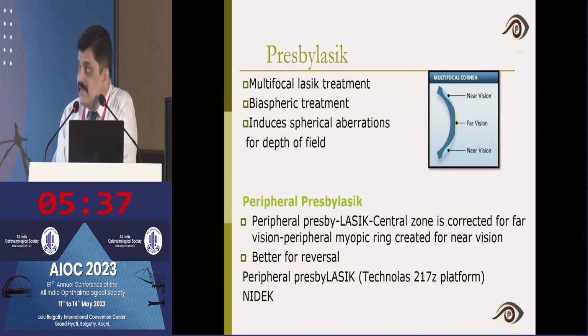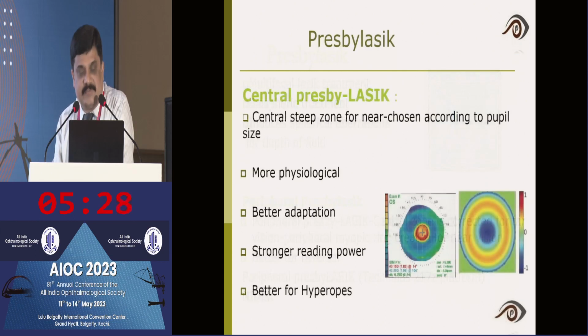So Presby LASIK, I think probably Dr. Srigani started quite long back. Then, because we have to repeat this treatment, for that reason it has become quite unpopular. So this is about the central Presby LASIK.